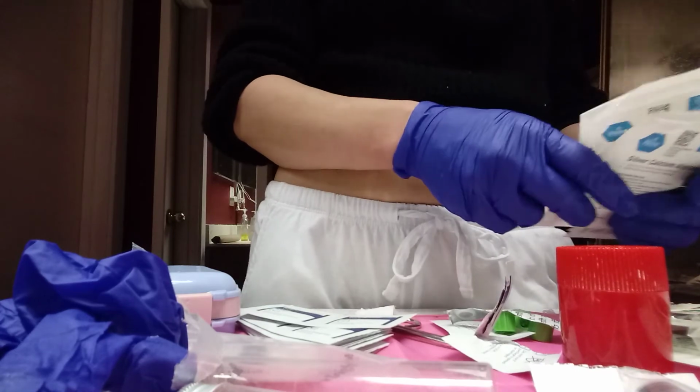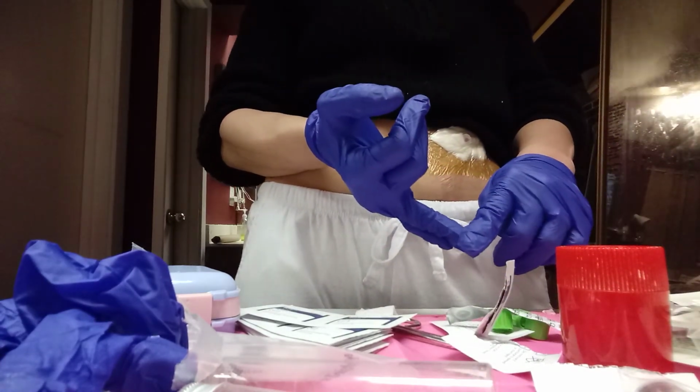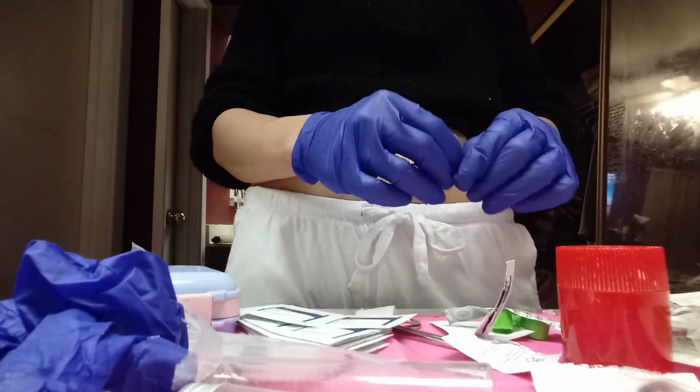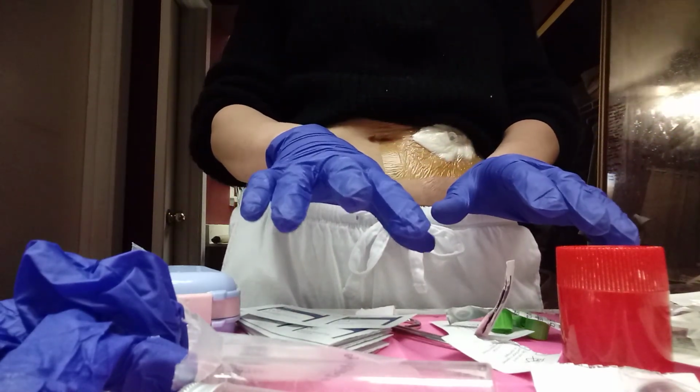So I hope this video helps you. Hand sanitizer, gloves, okay, alcohol. Make sure you have all these things with you. If you have questions, let me know, but all these things are available on Amazon, okay?